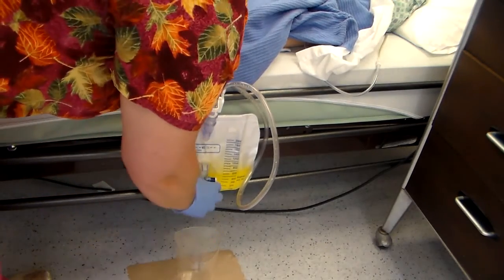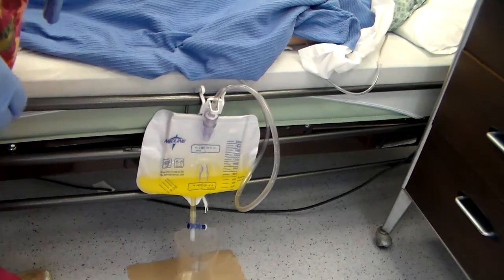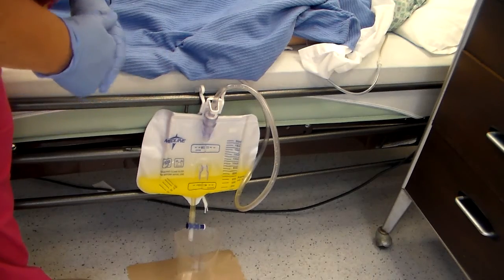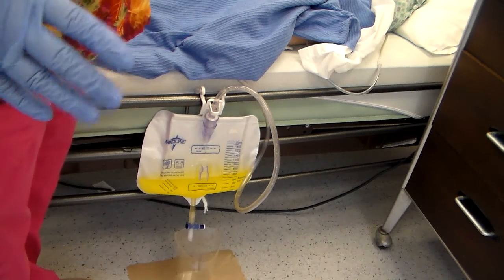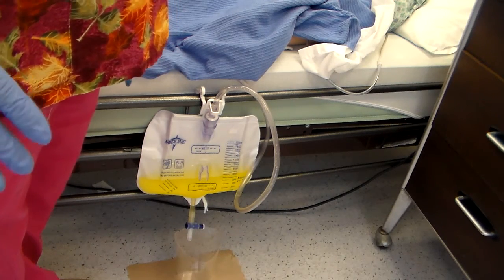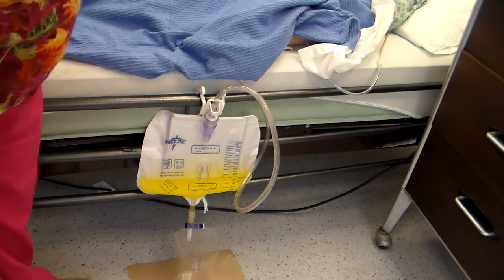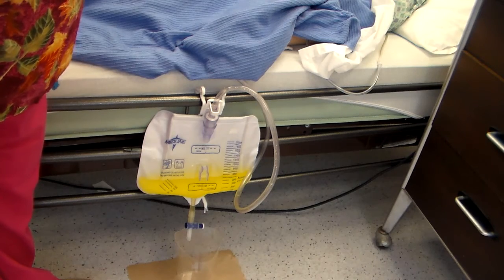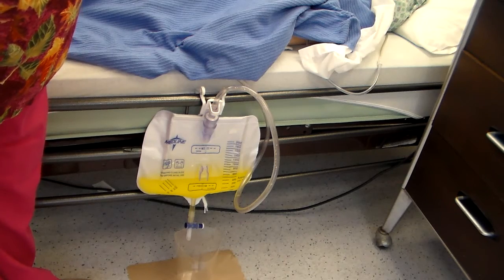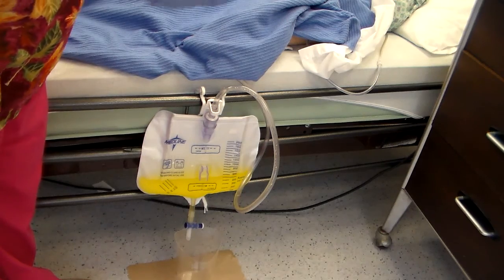We're going to remove this tube from here, and see? It doesn't drain. That's okay because we didn't hit the button. There's a safety device on it. Every facility is going to use a different Foley bag. You just have to get used to the collection bags being used at your facility. This one's a push button, some of them might be a clamp, but every single one of them will have a safety or closure to it, so that we stop the flow of urine, or we stop germs from getting in the bag.